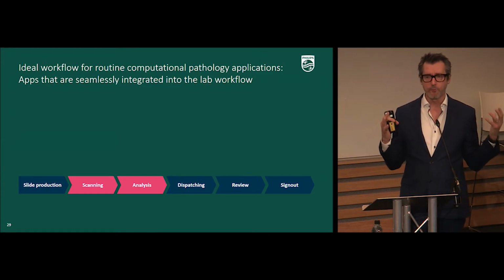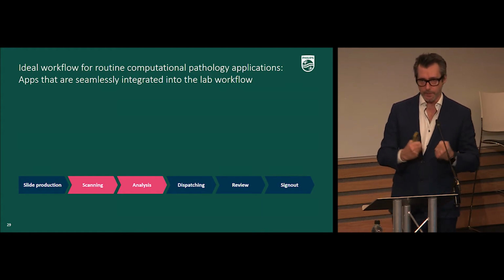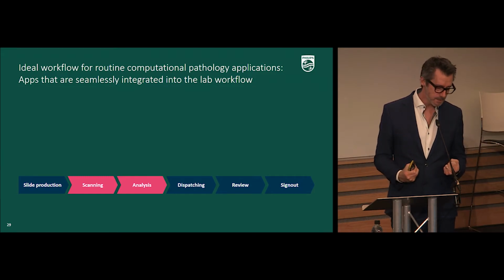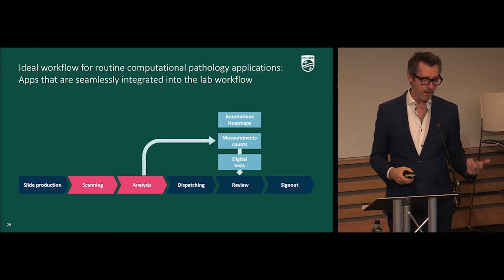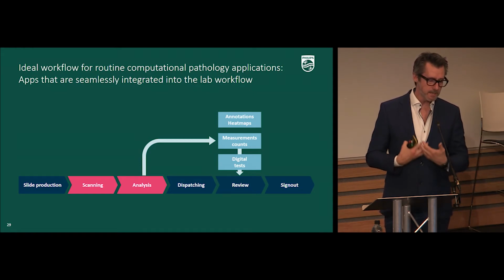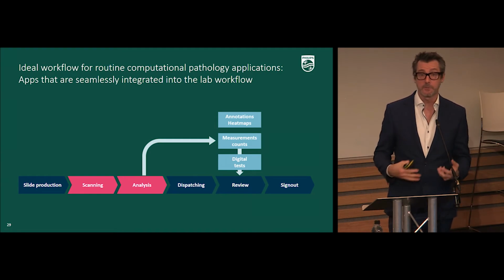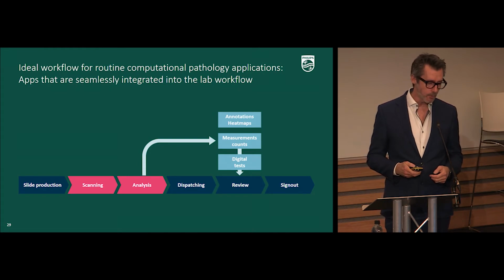And Philips are working really hard to build the correct and appropriate infrastructure within their technology stack to make sure that this happens seamlessly. That analysis will allow us to do a number of things. It'll allow us to ensure that when the pathologist reviews the slide at the time of review, they'll have access to all of the annotations, heat maps, the measurements, the digital tests to allow them to make those decisions, and where those decisions will be better informed.